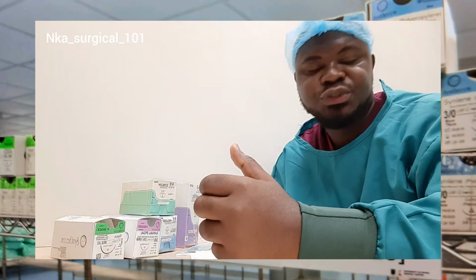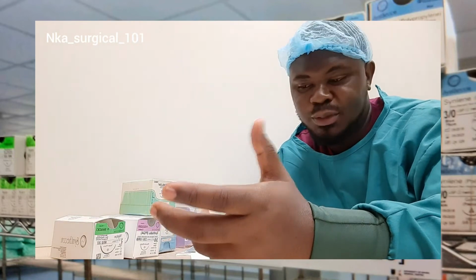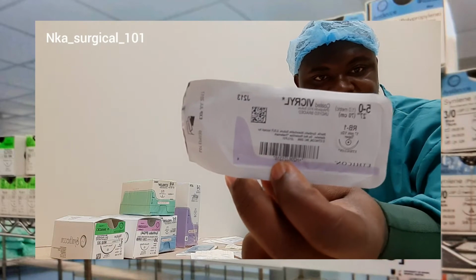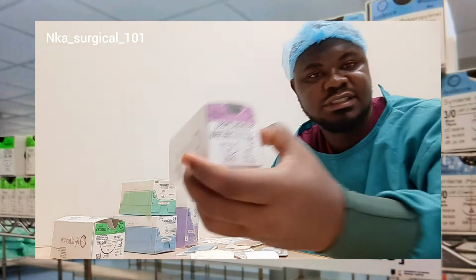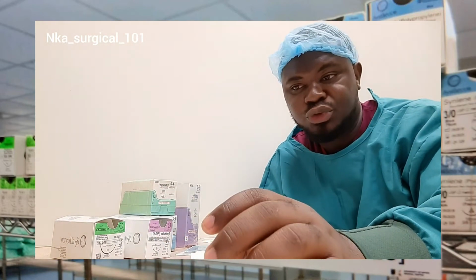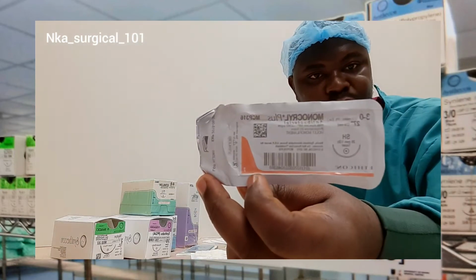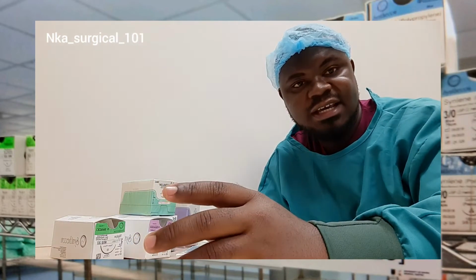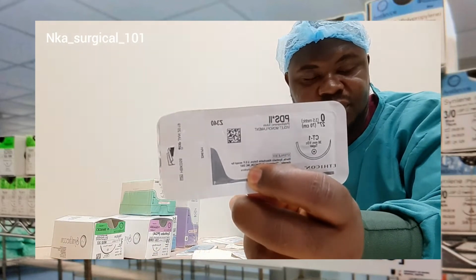So with absorbable sutures, an example of a synthetic absorbable suture is the vicryl. And this is how the vicryl looks. This is one piece of a vicryl suture, and then it comes in a box like this. Another example of a synthetic absorbable suture is the monocryl, and this is how the monocryl suture looks. Another example is the PDS, and this is how the PDS looks.